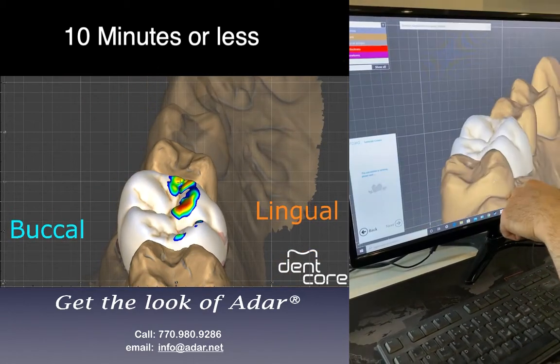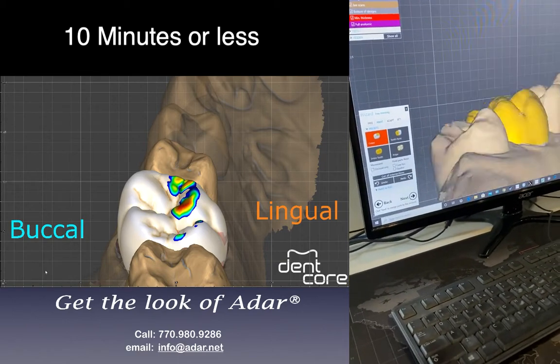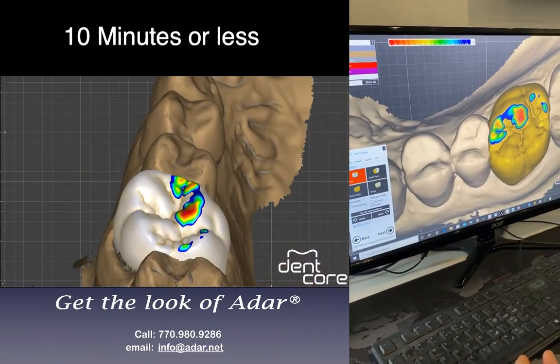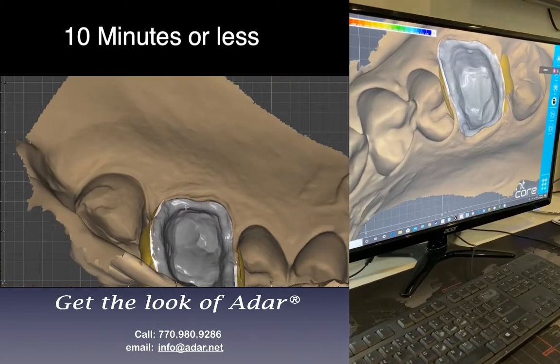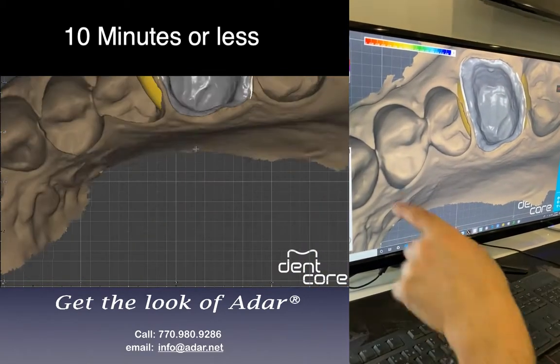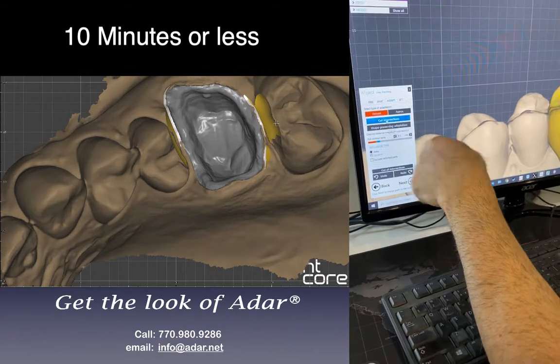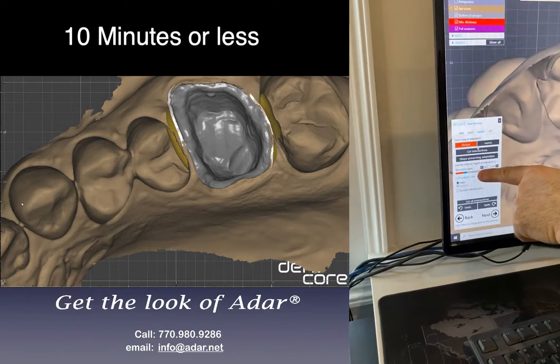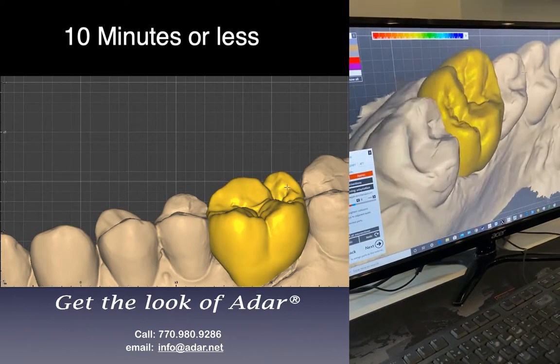Now it adapts — it adapts the margin, adapts everything. I also like to change the true smile to this yellow look because I can see the shape better. Then I'm going to get rid of the high spots — it's very high here. If you look at the contact points, they are very heavy, too much. So I can use the adapt tool: occlusal first — cut intersection — and it flattens that automatically. Same thing on the interproximal — go to interproximal, cut intersection — it's done automatically. That's enough for contact points.